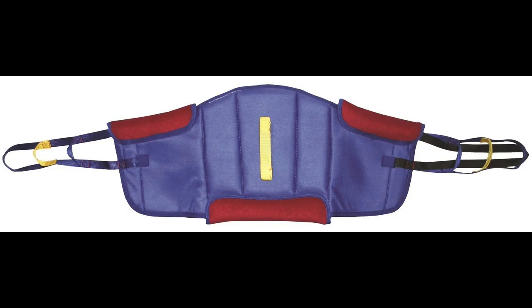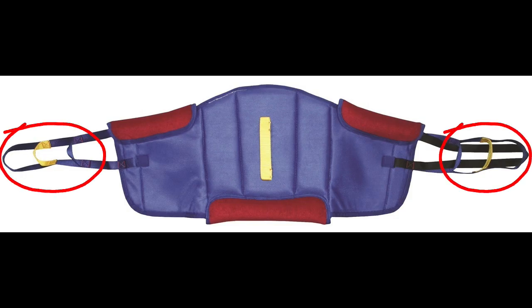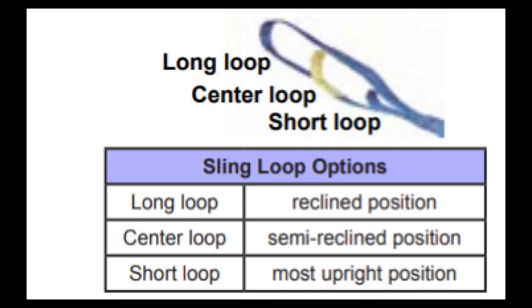First of all, you'll notice 3 attaching loops on both ends of the sling. The 3 loops are designated for use by determining the position of the person being lifted. Use the longest loops on either end of the sling if the person is in the reclined position, like on top of a bed or on a recliner that doesn't operate when the power goes out. Use the middle loop positions if the patient is in a semi-reclined position, and the 3rd set of loops, or the shortest, can be used if the IBMer is in the full upright seated position.